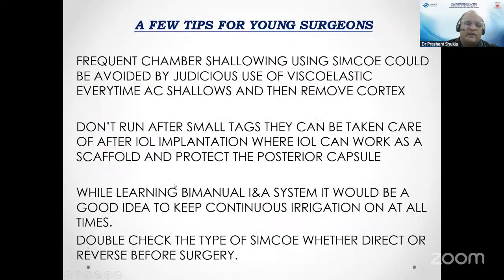Well, a few tips for all the young surgeons who have joined us. Frequent chamber shallowing while using a Simcoe cannula could be avoided by using a good amount of viscoelastic every time the AC shallows, and then remove the cortex. My mentors have told me, please don't run after small tags. They can be taken care of after IOL implantation, where the IOL can work as a scaffold and protect the PC.